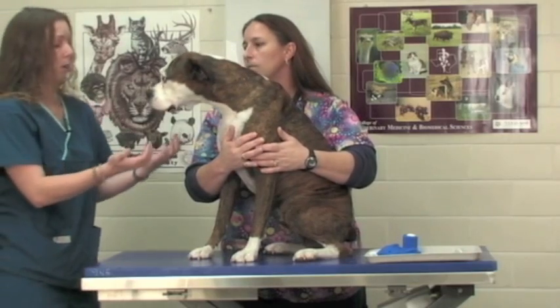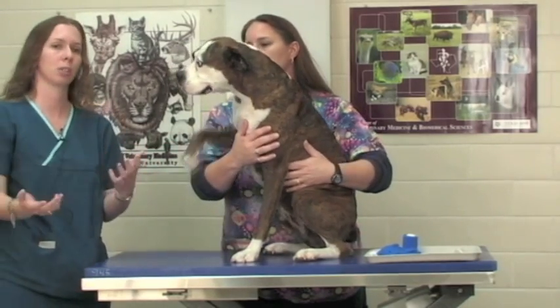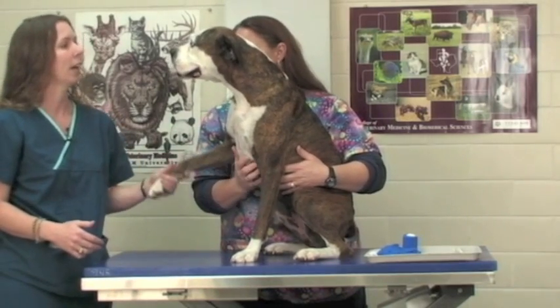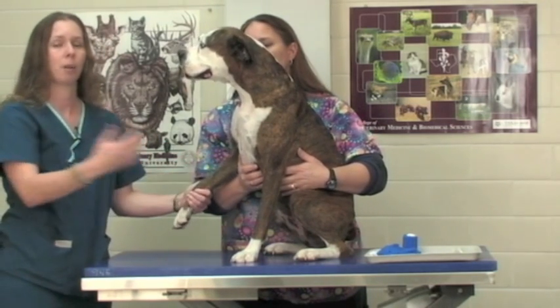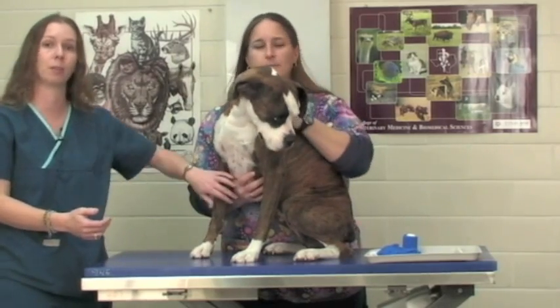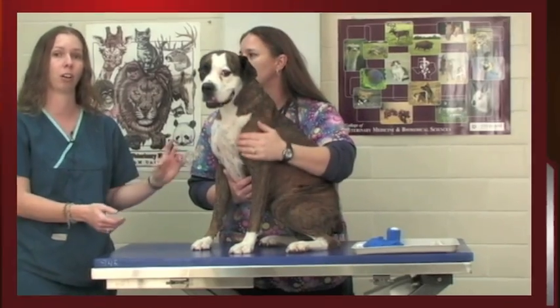For basic purposes in a clinic setting you would most likely draw blood from the front leg, which is the cephalic vein. Here at the vet school we usually try to save these vessels for the purpose of placing IV catheters, but in a clinical setting and a private practice you would most likely be drawing blood from this vessel. So we are going to go over the procedure for drawing blood from a cephalic vein.